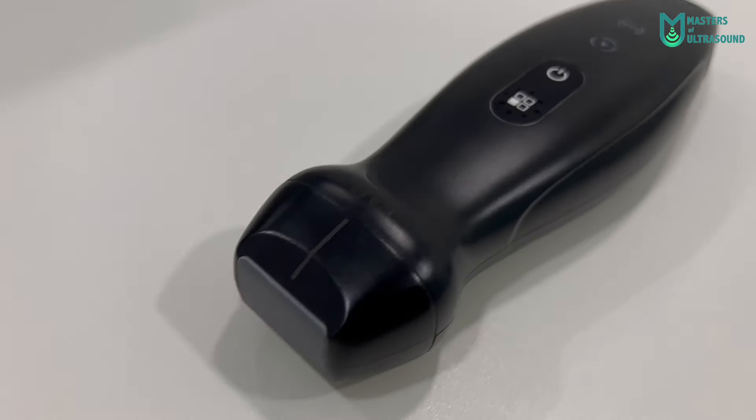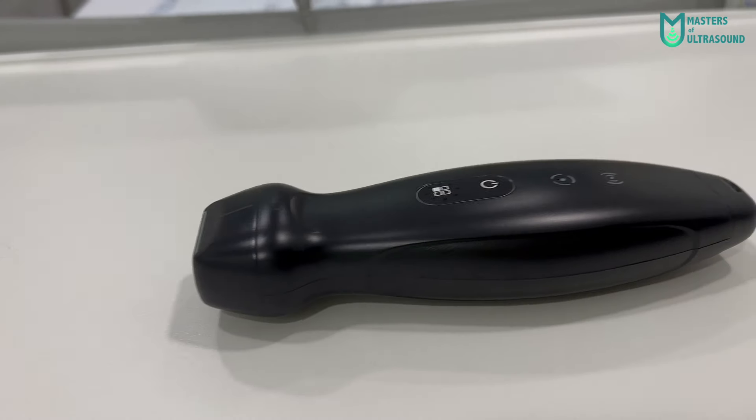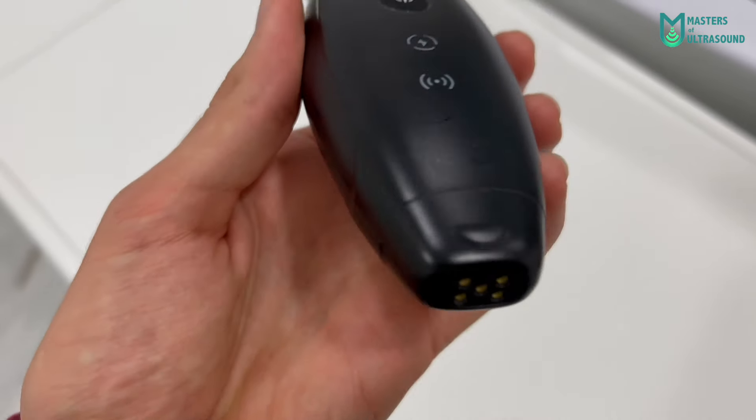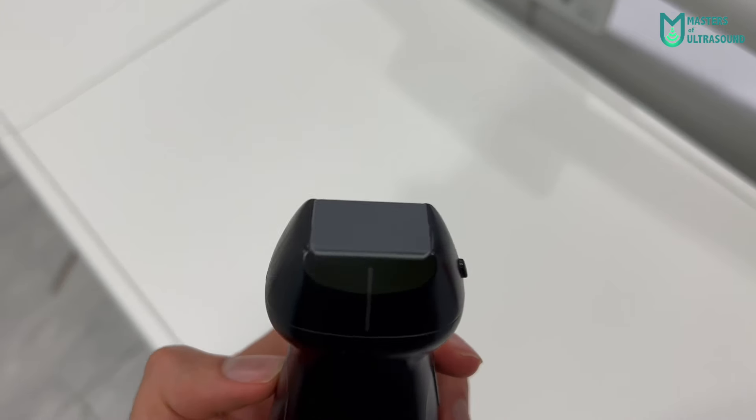It's very lightweight and magnetically attached to the case. It has soft edges and an ergonomic design. You can also see the two physical buttons: one for powering on and off, and another is a multifunction button, plus two light indicators — one for wireless connection and the other for battery status.